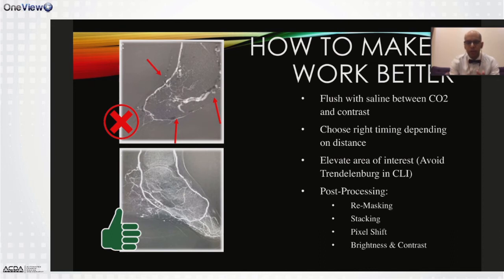You or your technologists that work with you need to understand this. Probably this is the most important part of everything. They know how to do all the 4 factors. I'm not going to go through them now. I'm sure your technologists know it. AngioDroid have very good training in this, and they can teach most of your staff how to do this. It makes a big, big, big difference in having a nice picture in the end.